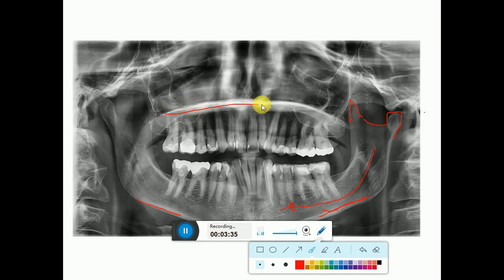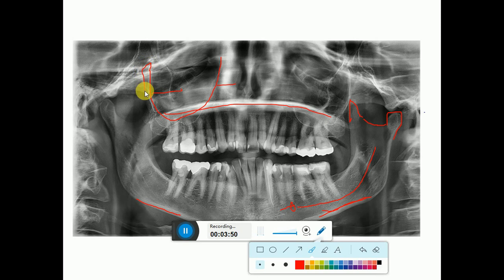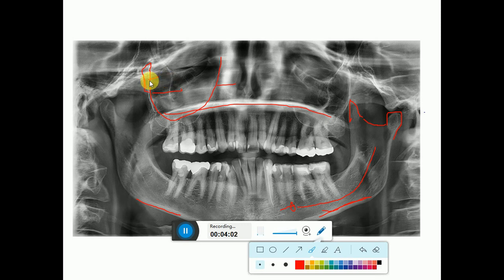Now we move toward the maxilla. This is the hard palate, and here we can see the maxillary sinus — this is the medial wall and this is the posterior wall. Here we can see a space between the posterior wall and the pterygoid plates — this is the pterygo-maxillary fissure. It is very important because when there is pathology of the maxillary sinus involving the posterior wall, it will obliterate this structure.